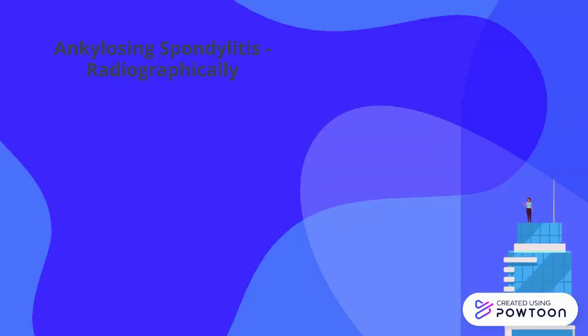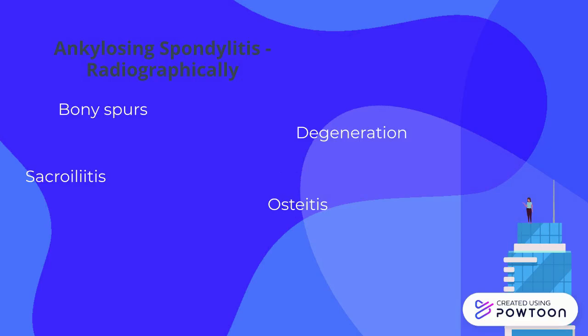On radiographs, ankylosing spondylitis is characterized by bony spurs called syndesmophytes that can cause bridging of the intervertebral discs leading to ankylosis, degenerative bony spurs, bilateral and symmetrical sacroiliitis, osteitis, erosion of subchondral bone that appears as joint widening, reactive sclerosis, and a loss in definition of articular surfaces that is accompanied by osteoporosis.